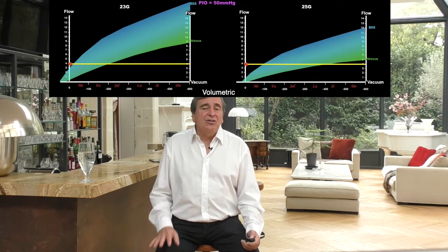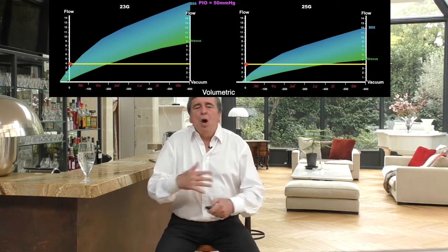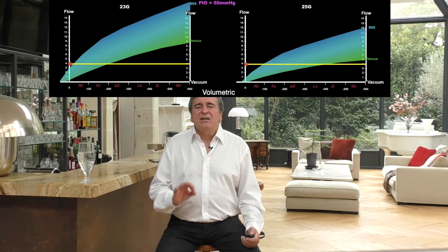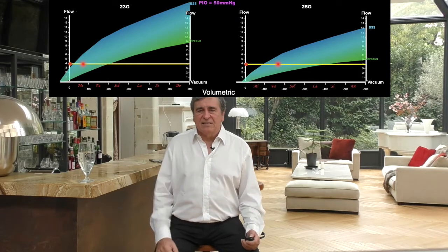When it has done this central vitrectomy and gets closer to the peripheral vitreous, the operator using a flow control will decrease his flow rate to allow him to control the vitreous, which will enter the port slowly, regularly, and continuously. For example, he can choose a flow rate of 4 cc's per minute and can cut slowly or quickly. It's up to him. He will decide. There is no risk of unpleasant surprises.